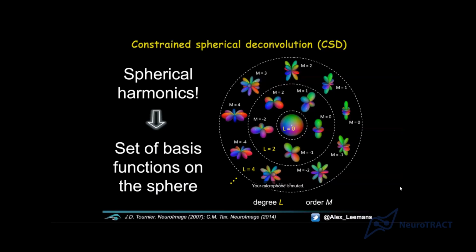And remember, the diffusion profile is a centrosymmetrical phenomenon, right? You've got the starting point, and then think of an isoprobability surface growing. But the shape and size, well, it is symmetric because diffusion going left is the same as diffusion going right. There's no difference. It's centrosymmetric, antipodal symmetry. I think that you also can call it like that.